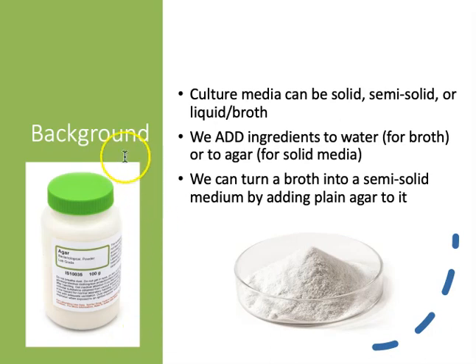Over here on the left-hand side of the slide, you can see a container of powdered agar that was purchased from a supply house. This powdered agar is harvested from a certain kind of algae that use agar in their cell wall. Remember, agar is just a complex carbohydrate.